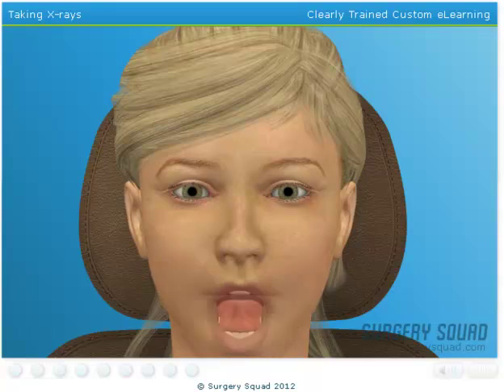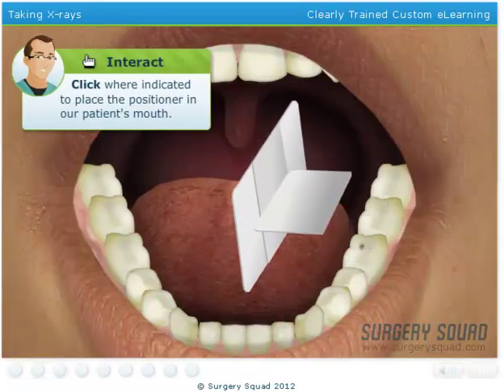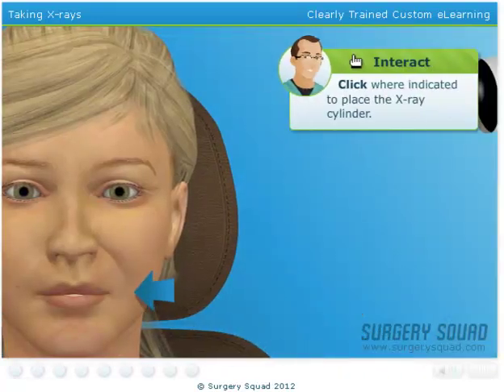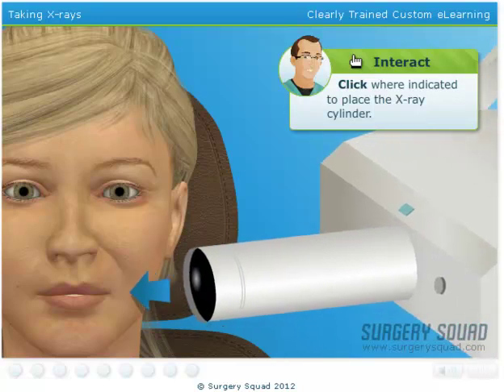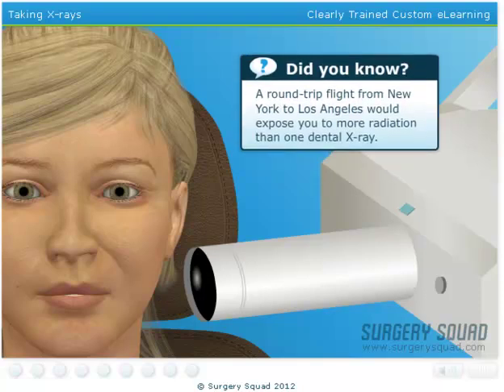Let's get started. First, insert a positioner into the patient's mouth. Next, position the x-ray cylinder where indicated. With the x-ray cylinder in place, we need to get behind our radiation barrier to reduce the amount of radiation we're being exposed to, and take the picture. The lead apron will protect our patient from any unnecessary radiation exposure.